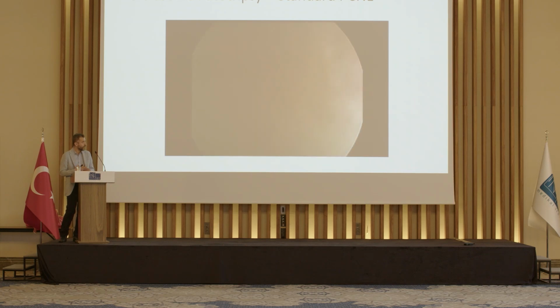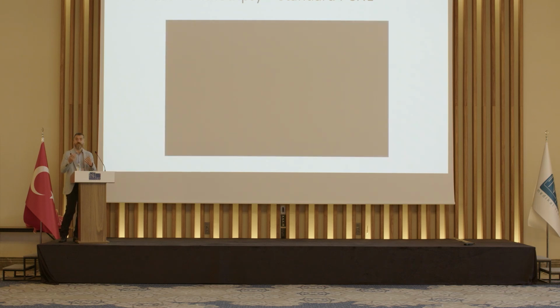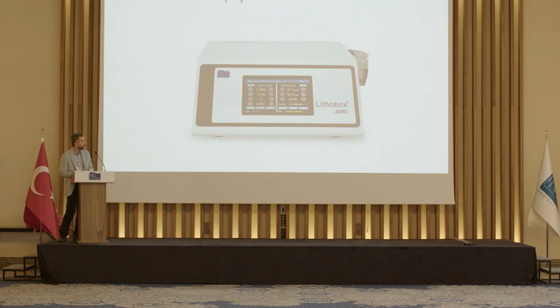And also you need to have good irrigation, which also needs suction. I do my stone surgeries in supine position mainly, so the patient is just lying down and the water is also coming out of the sheath very spontaneously and very fast. So good irrigation is very important, it's mandatory for these cases. And in the end, in such a huge stone burden, it just took less than half an hour to disintegrate the entire stone and take all of the pieces out. And this is the stone dust that we had after the surgery, and we also washed out a lot of fragments from the system. It's a very efficient lithotripsy.